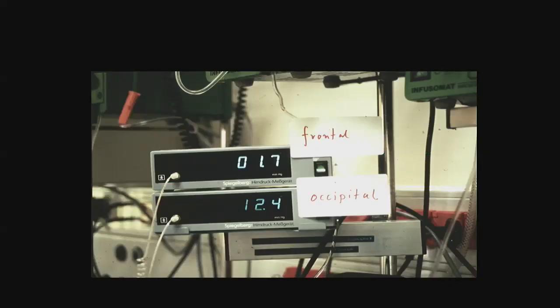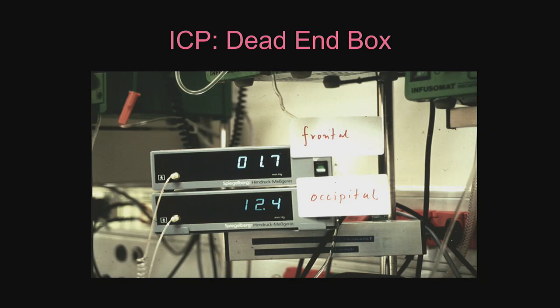But you need something, because there's a weakness to what I called the dead end box, right? So this paradigm is stupid, right? There's a continuously displayed physiologic number like an ICP or brain oxygen, right? And it's there, it's never being recorded, it just floats away into nothing. And at the top of the hour, the nurse goes, 12.